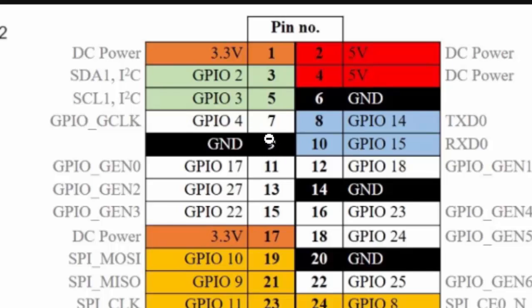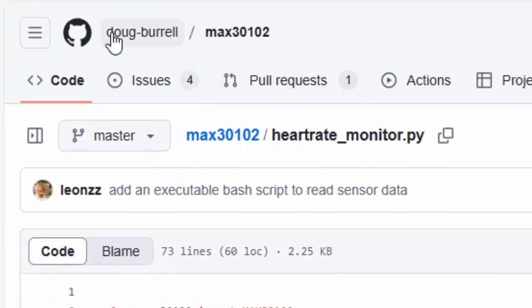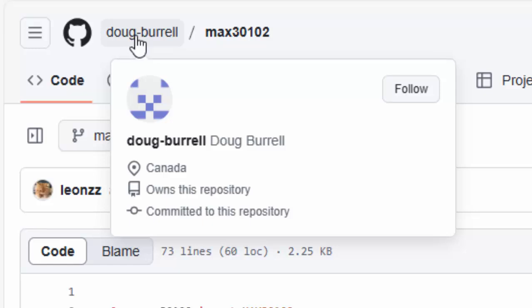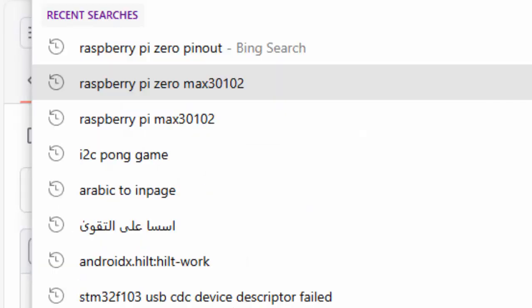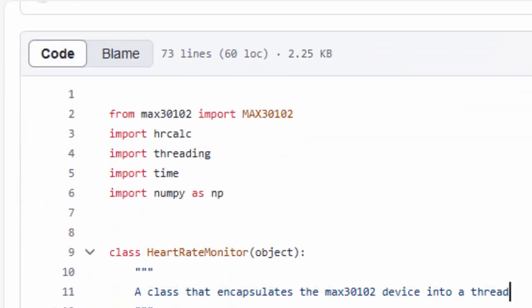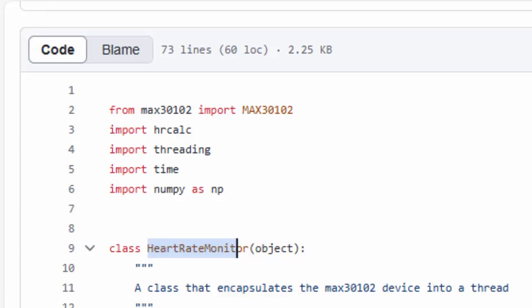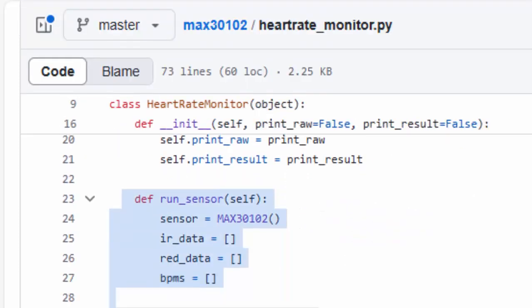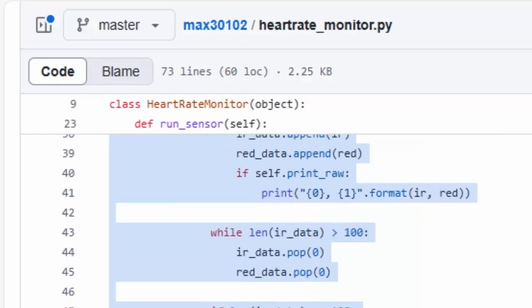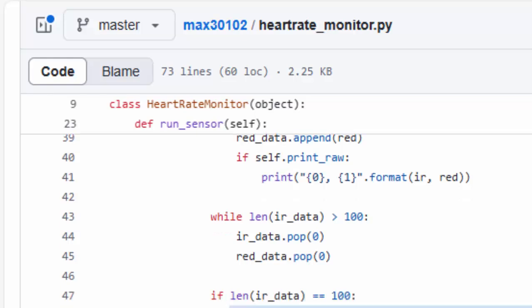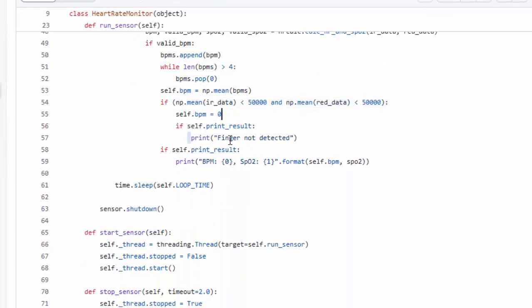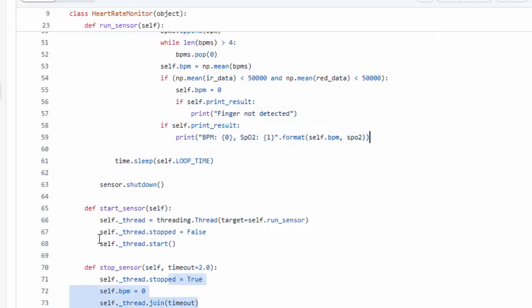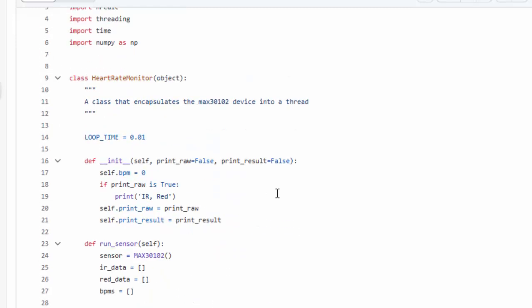There is a very good library available for MAX30102 in Python for the Raspberry Pi by this dog barrel repository. I will pin this repository's link in the comments. This repository has a class of heart rate monitor which utilizes the sensor in a thread mode and creates a Python thread which in the background continuously reads the heart rate and the SPO2 calculations. It also indicates the mean value and if the finger is not detected, and it returns the BPM value. There are start sensor and stop sensor functions which start and stop the thread, so the sensor continuously runs in the background.